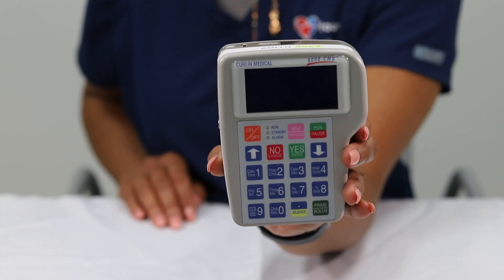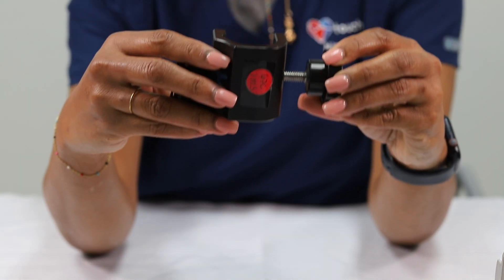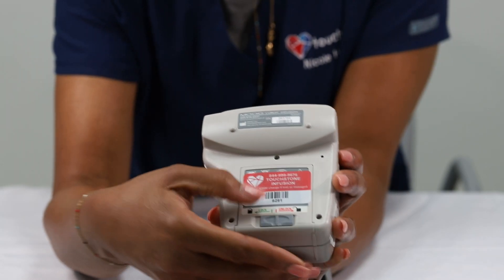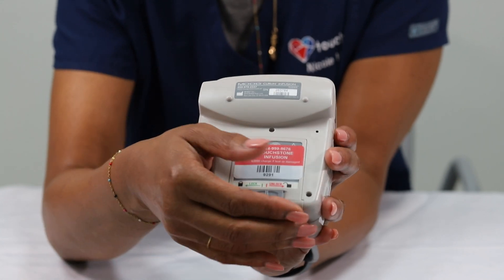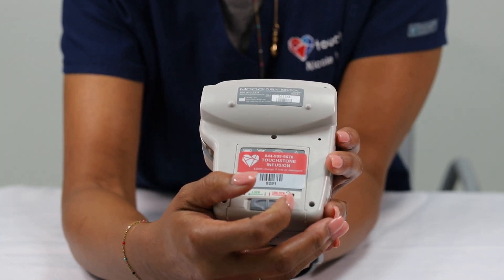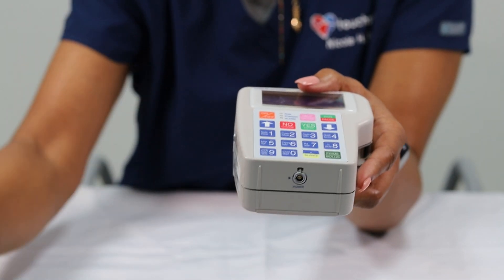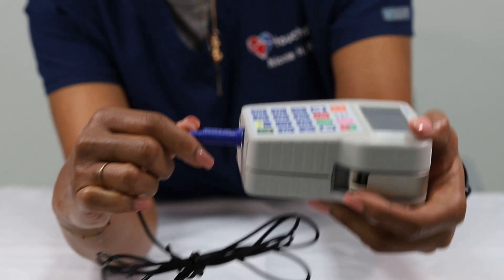In your delivery box, you will receive two Curlin pumps, one pump holster, one pole clamp, and one wall adapter. The battery compartment is located on the back of the pump. Touchstone pharmacy will supply two C batteries for each day of therapy. The wall adapter is located underneath the pump. When the adapter is plugged in, the batteries are bypassed, thus conserving battery life. The pump can stay plugged in or run off of battery power.